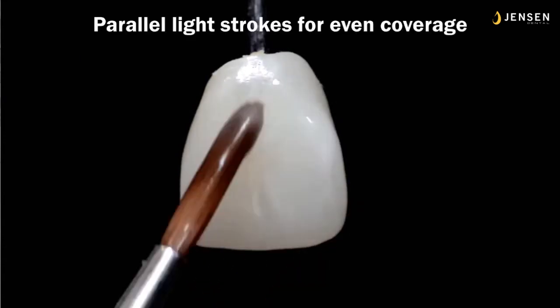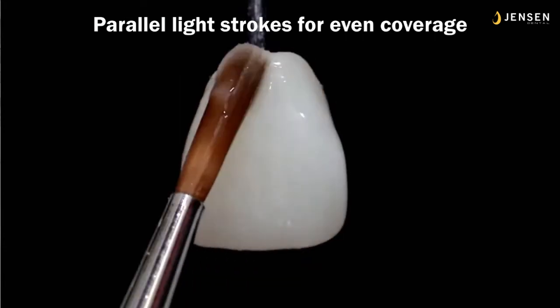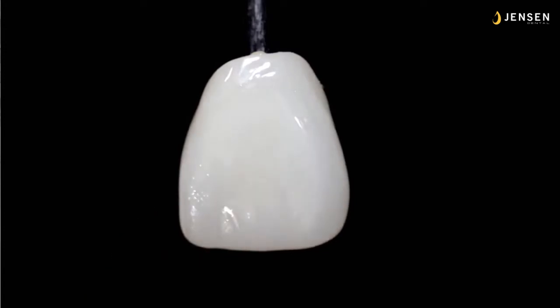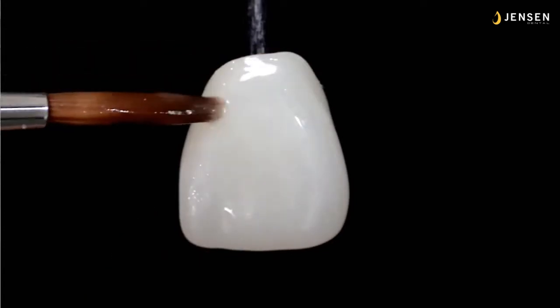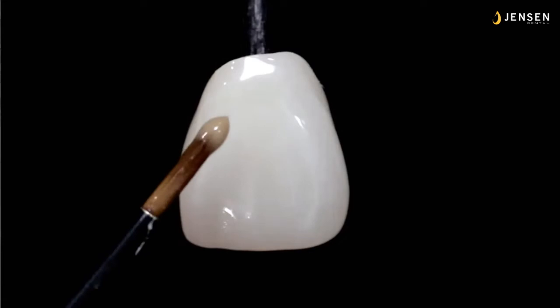So here I am covering. I'm going to just cover the facial. I mean, this is just to show you what you need to do. So just remember a parallel stroke. You don't want to apply any pressure. You just want the material to slide off the brush. You really don't even have to bend your brush. So there's an even coat, and I'm going over it a couple more times just because that's what you do when you're on video. There's my #2 MiYO brush, which is the size of a 00 brush from Art Supply.